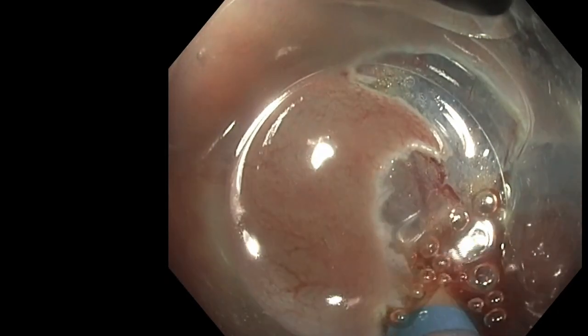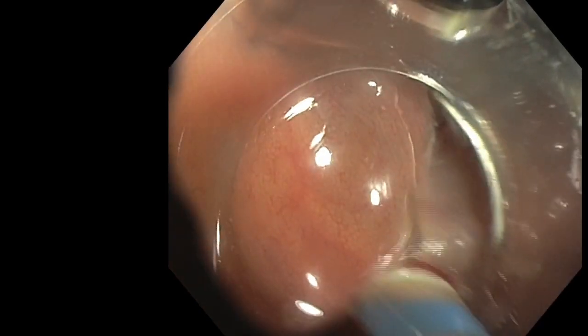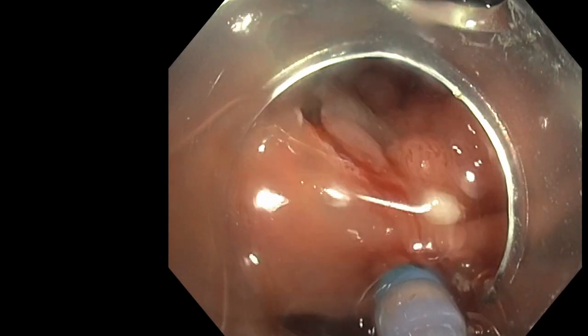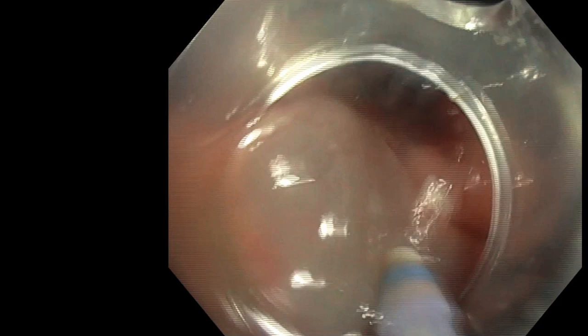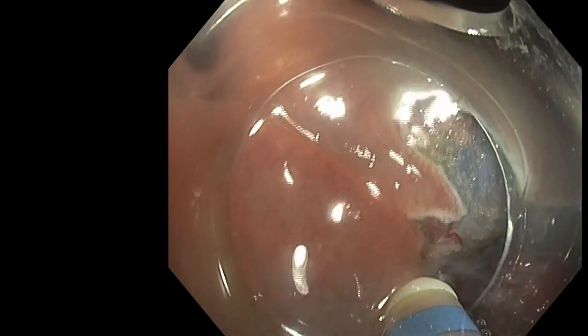So it's very important to prepare the end of the resection by doing this circumferential incision and trying also to do a circumferential dissection in order to have a strong traction at the middle of the diverticula for the end of the resection.